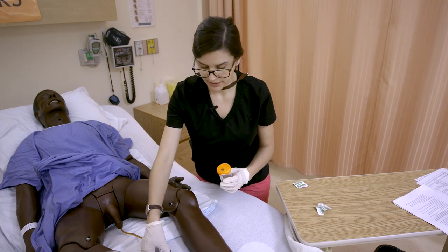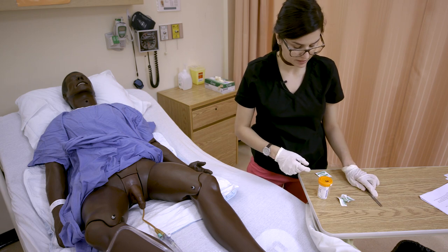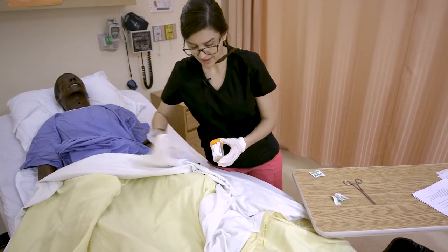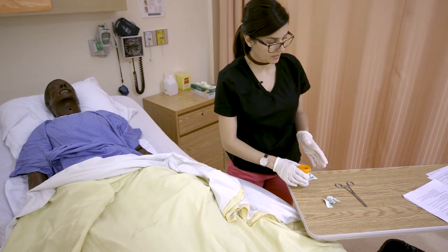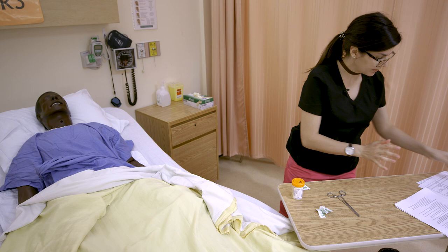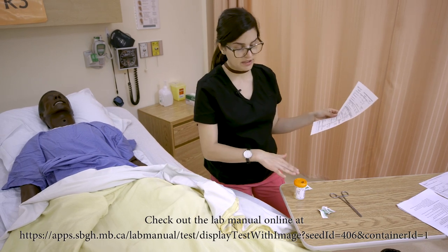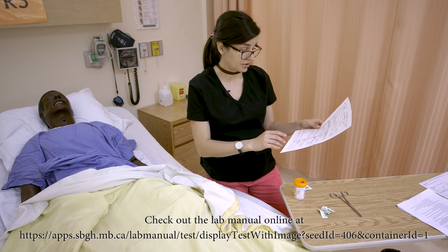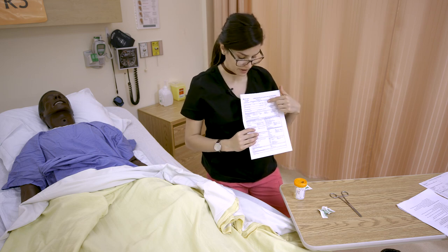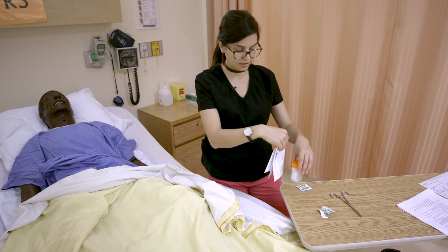An important step: don't forget to unclamp the Foley. Leaving it clamped will cause an occlusion and the patient can't freely drain urine. Make sure you unclamp the catheter. Then, when sending this to the lab, make sure you have the correct requisition and label the specimen container with the patient's name and information. On the requisition, check off where the sample came from and what you're testing for — in this case, bacterial culture aerobic under urinary tract specimen. The specimen goes into a zip-lock bag with the requisition at the front, and they get sent off together.